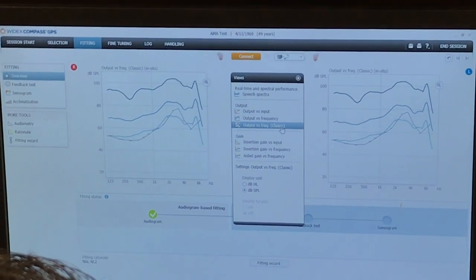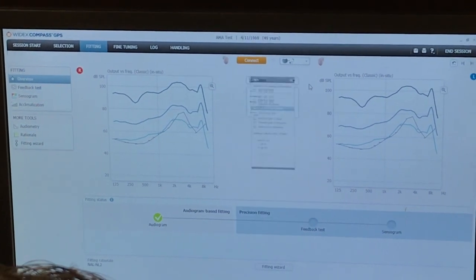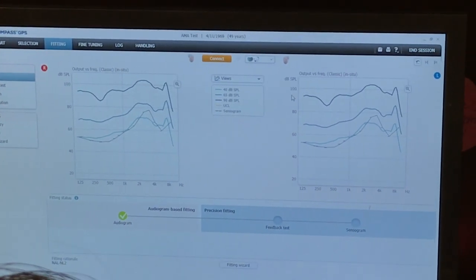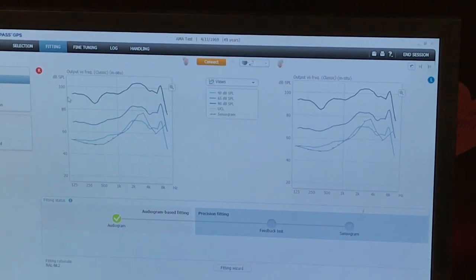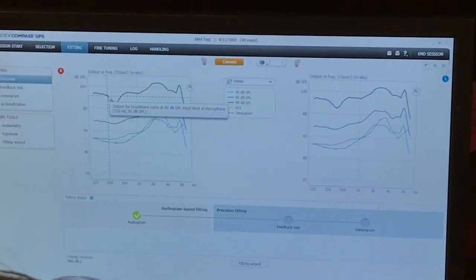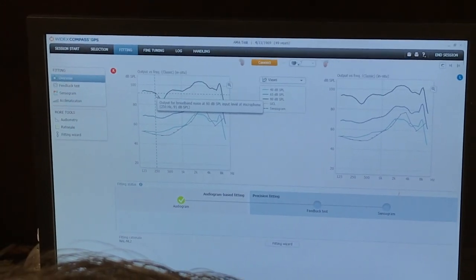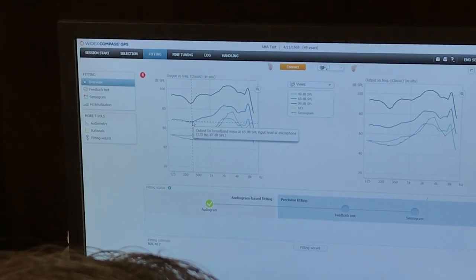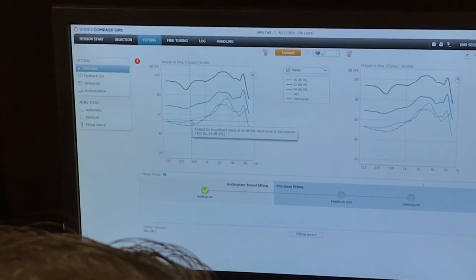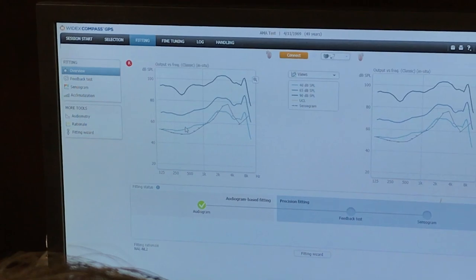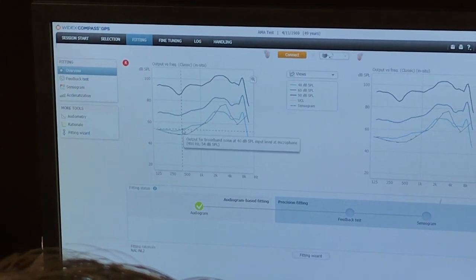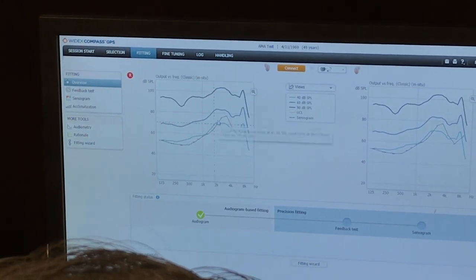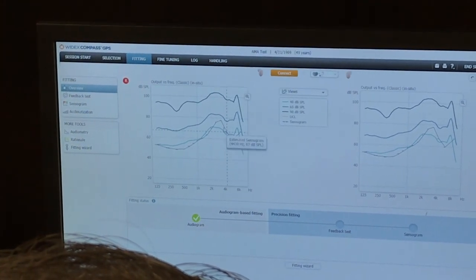Output versus frequency. So what this is, here's my 90 dB curve, 65 dB curve, and my 40 dB curve. I don't know why it's so gross. And here's my audiometric threshold.